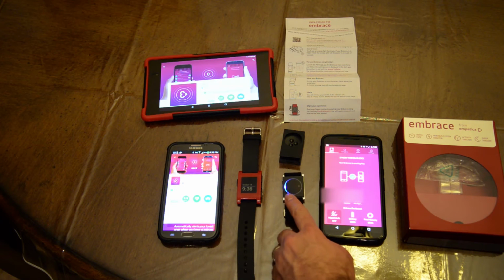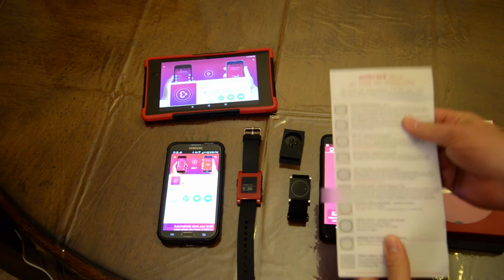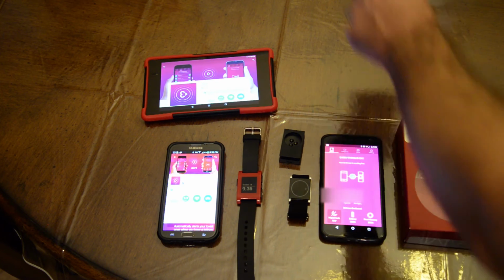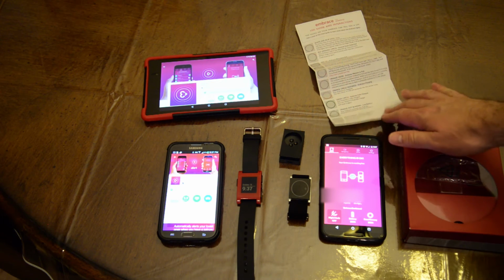Oh, that's cool. That's the time right now. It is 9:35. All the little color coordination are in the back. It's pretty important to understand. Really, the most important one is if you see red, and you would want to check those unusual events down, and they're all self-explanatory.